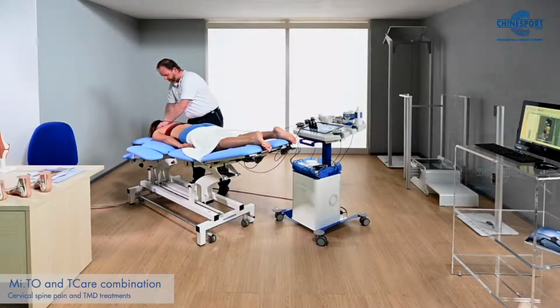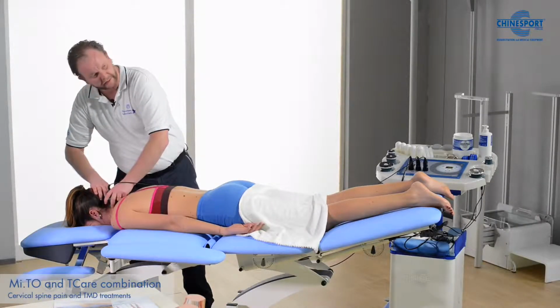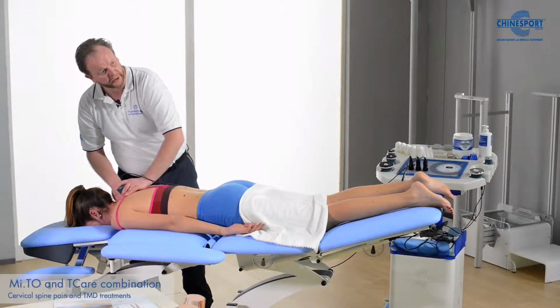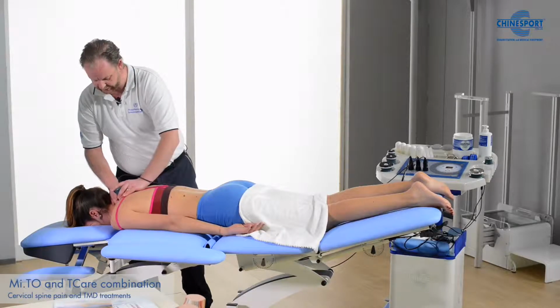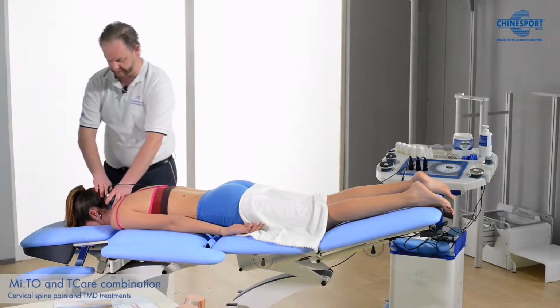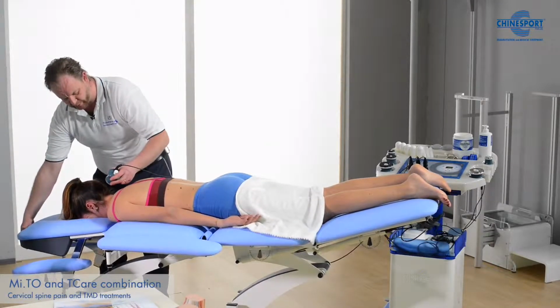We would always start with a capacitive mode warm-up, but then very quickly move to the resistive mode, and passively we could work on the trapezius muscles, maybe the levator scapulae. We could also work on the rhomboideae muscles, the suboccipital muscles, and then when we're ready, we can introduce some movement.